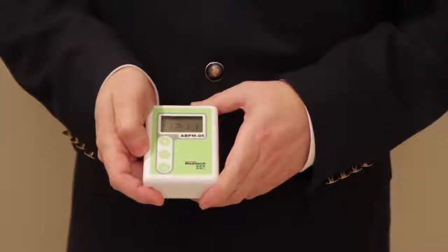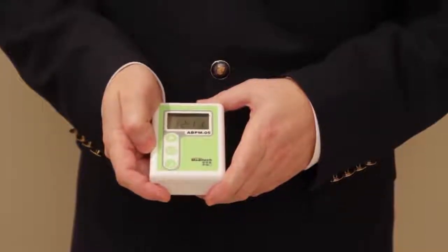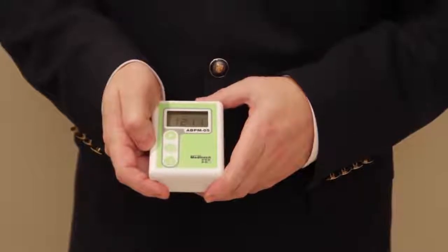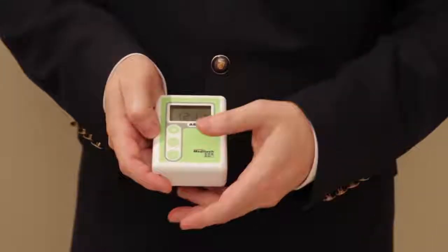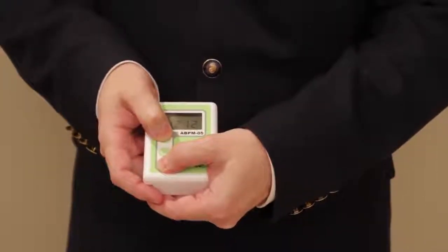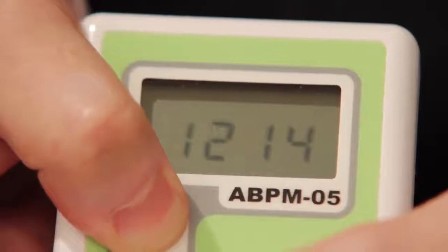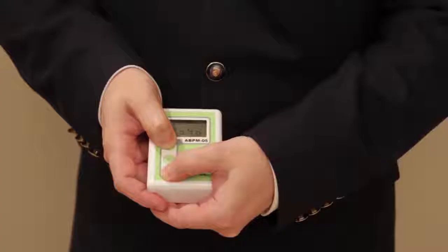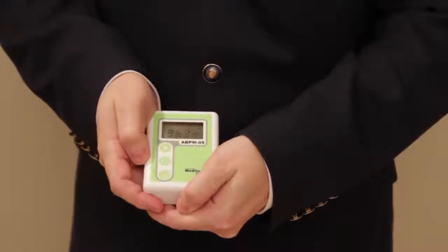In addition to being programmable from the computer, ABPM 05 can be programmed manually, without a computer, in which mode you can select one of 3 preset schedules for automated blood pressure measuring. To activate this feature, press and hold the day-night button and the start button at the same time. Wait 10 seconds. This seems like a long time, but this is inserted in the device to avoid accidental pressing. Then the device will show the available plans. When you have the plan that you would like, just release the buttons.